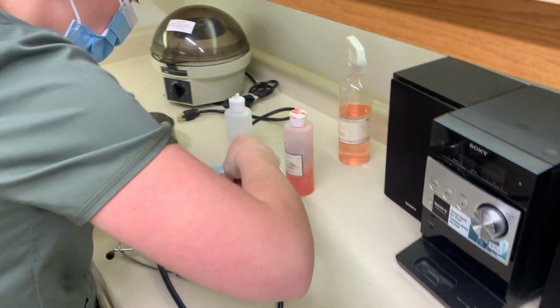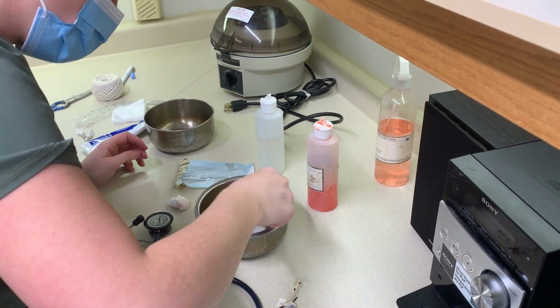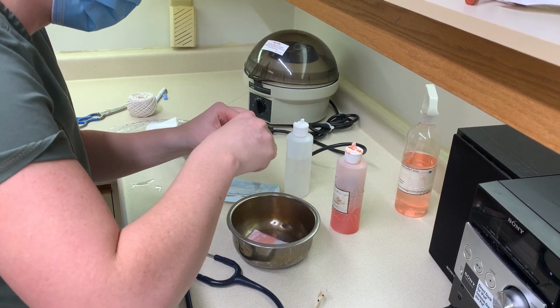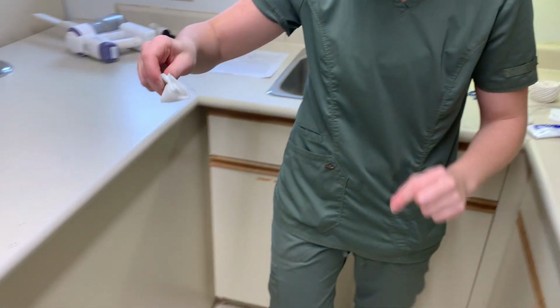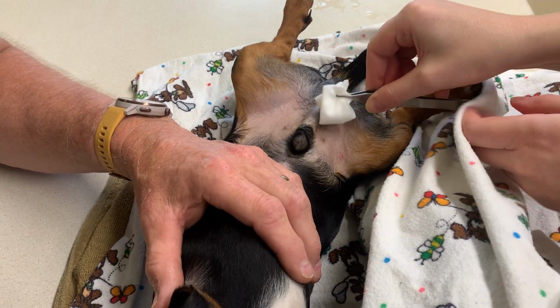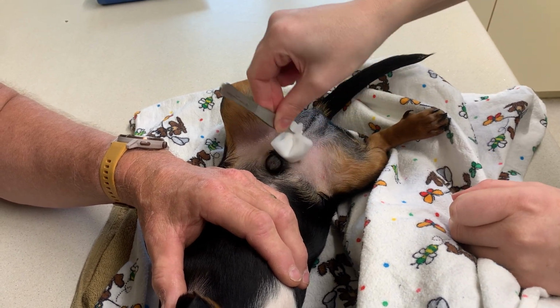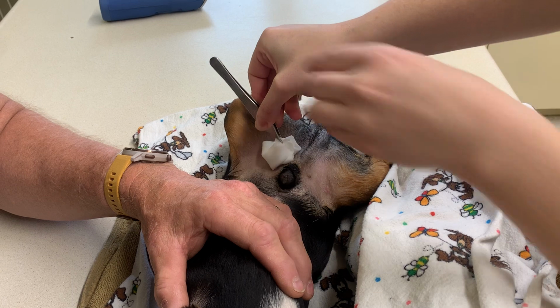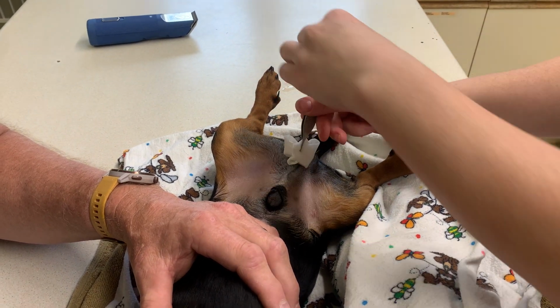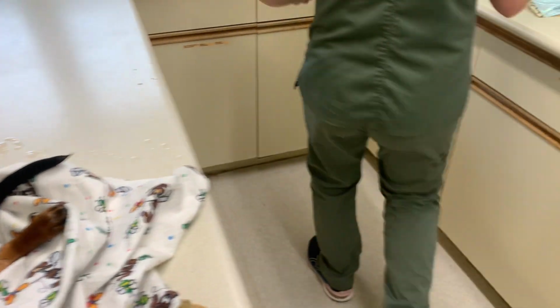So now what I'm going to do is take my one that is just alcohol here, and I'm just going to position it like so, and just grab it without touching my forceps. So then we're going to do the same thing. Start like this, and we're just going to work around in a circular motion. And then turning as I'm going, and using 2 hands because I'm not great at this yet. Okay, and that's the first one.